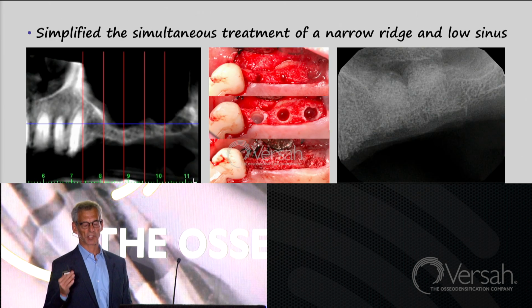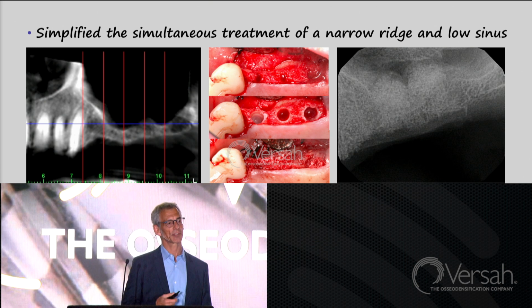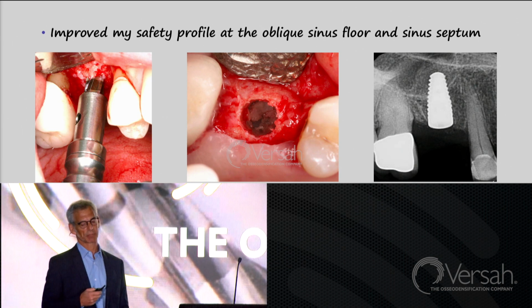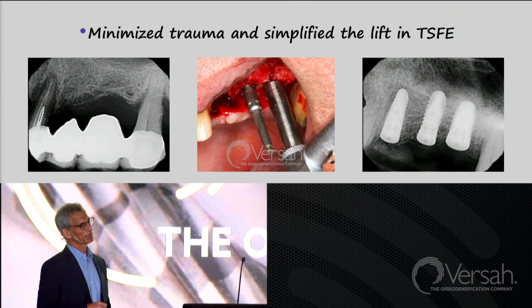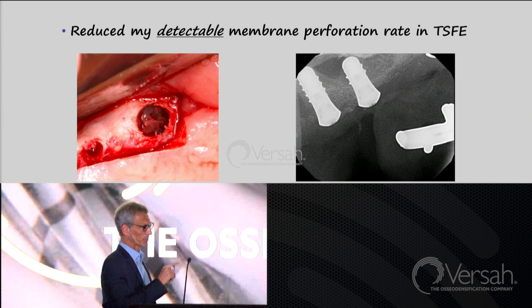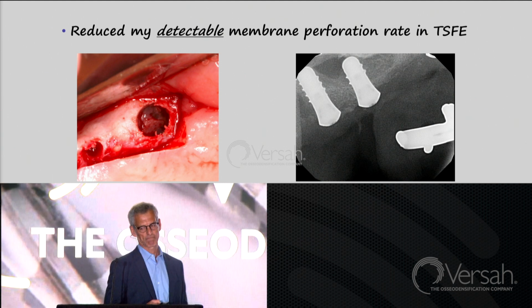And it simplified the simultaneous treatment of a narrow ridge and a low sinus, improved my safety profile at the oblique sinus floor and sinus septum, minimized trauma, and simplified the lift in transalveolar elevation, and reduced my detectable membrane perforation rate in transalveolar elevation.